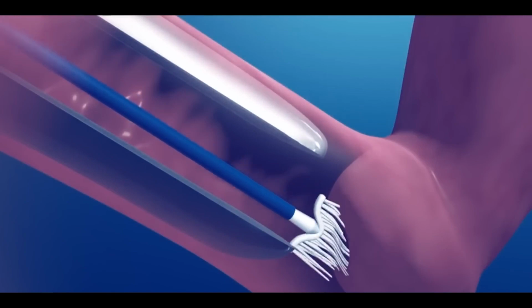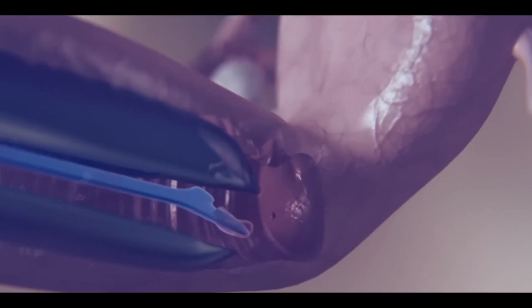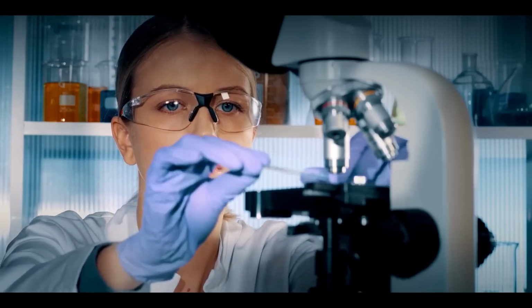Next, a soft brush or a scraping device, called a spatula, is used to collect samples from the cervix. These samples are carefully preserved and sent to a laboratory for examination.